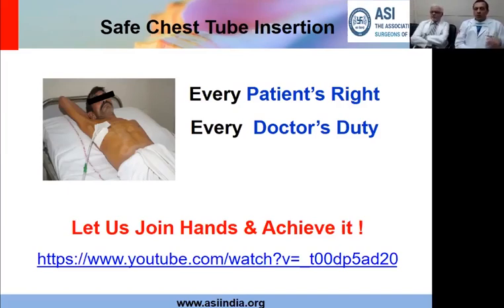See, there is no upper limit for keeping the chest tube. It also depends on the reason why. So if you need a chest tube to be kept beyond a few weeks, there has to be a reason. So what would be the reason? You are probably having air leaking out. If air is leaking out, then it's an indication for intervention.